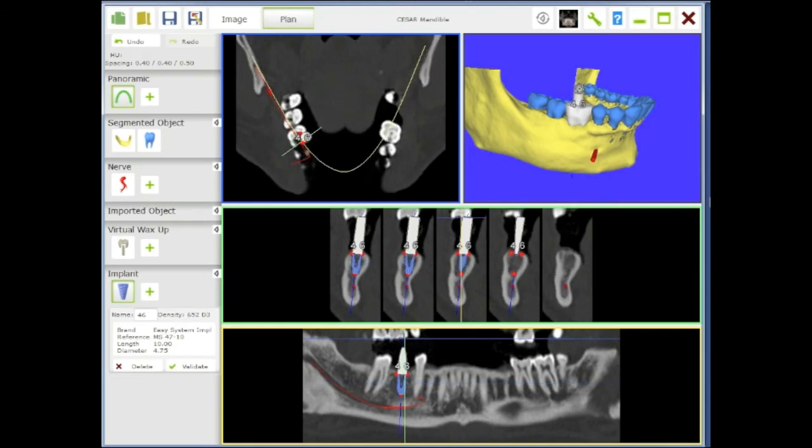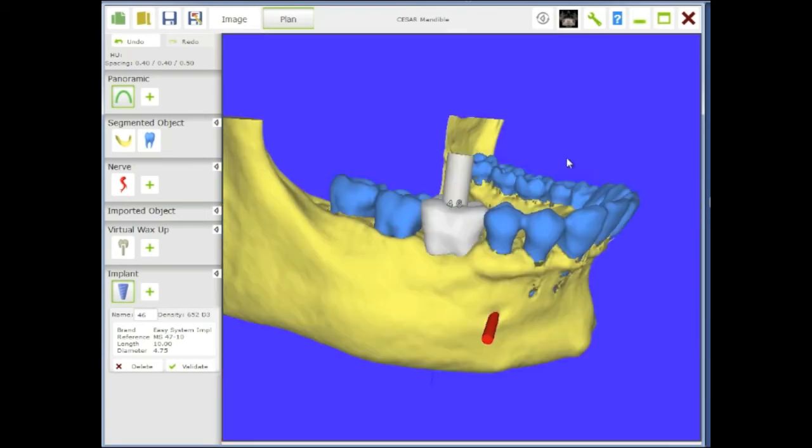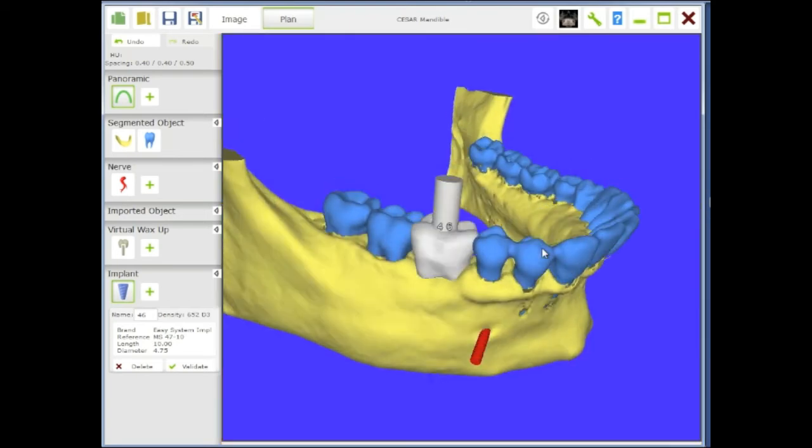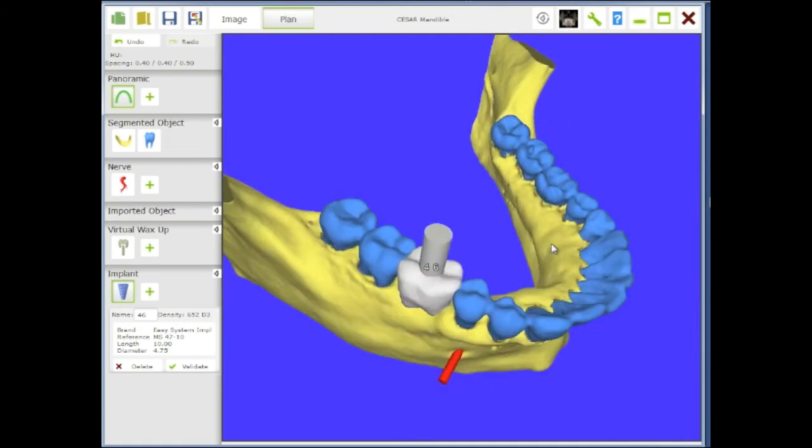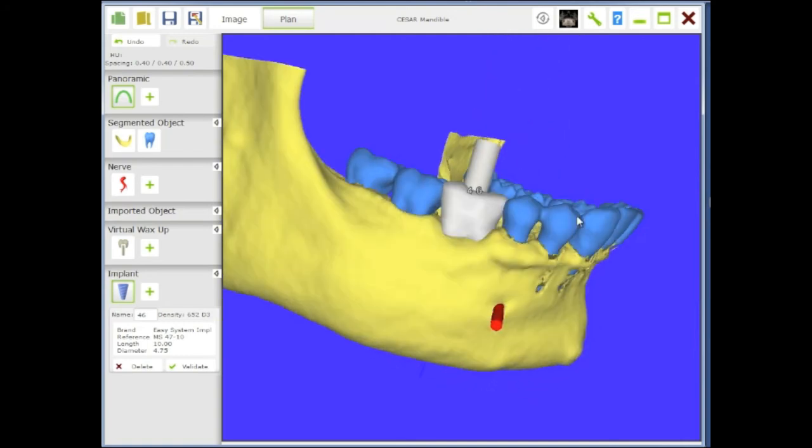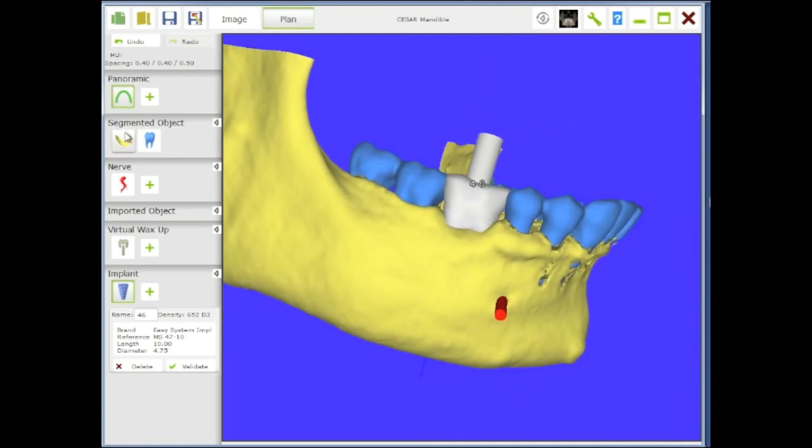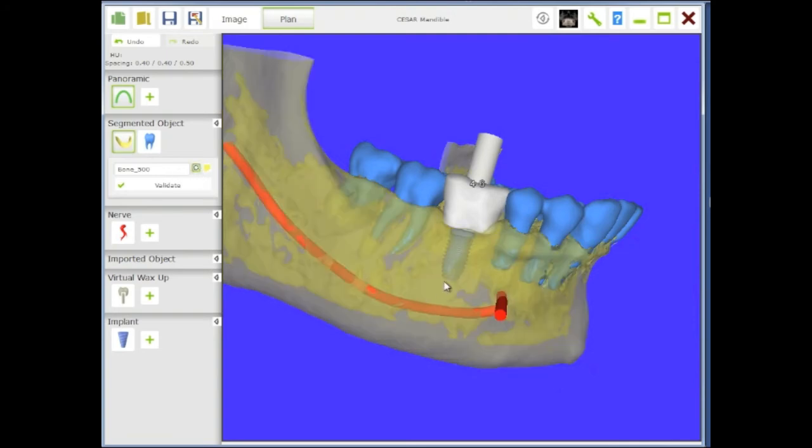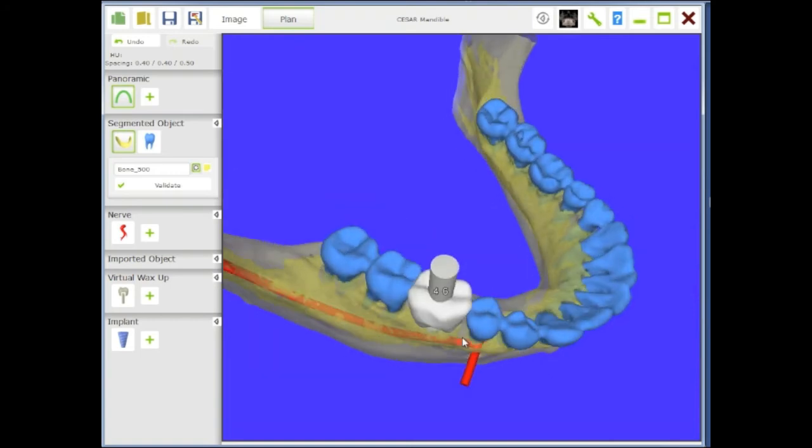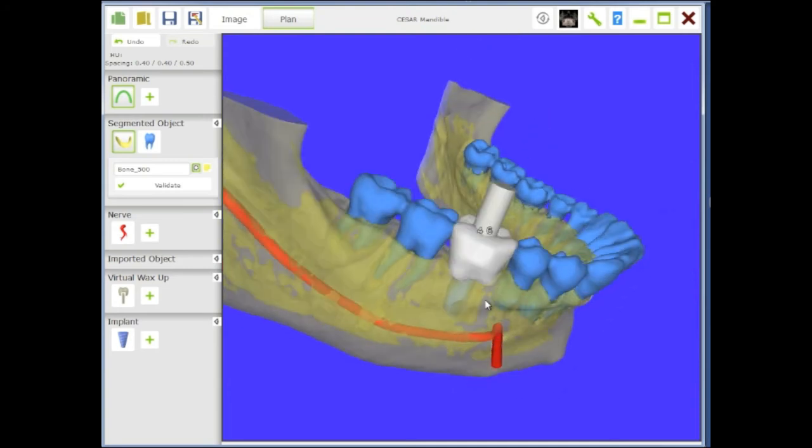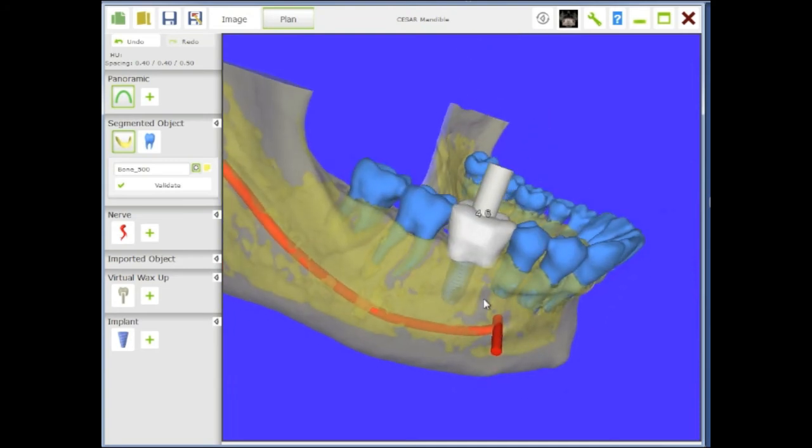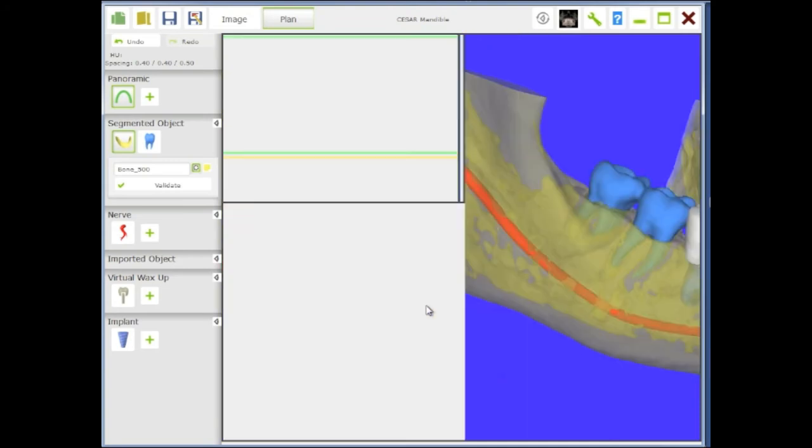Let's say in 3D, you check in 3D and you will have the perfect positioning of your implant in this case. You can see that by transparency if you want, and showing that you will be able to see where is your implant, where is the nerve, which tooth you want to replace, and this will be very simple to manage.